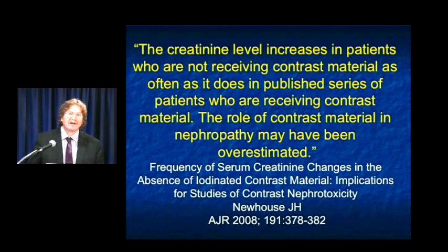If it's necessary, I'll lower volumes. These articles now are really suggesting that we tended to overestimate the worry. Article by Newhouse: creatinine level increases in patients who are not receiving contrast as often as it does in published studies of patients who are receiving contrast. The role of contrast material in nephropathy may have been overestimated. As I mentioned, people have done studies. Two people in the same room, one got contrast, one didn't. The creatinine levels often go up more in the patient who did not get the contrast.